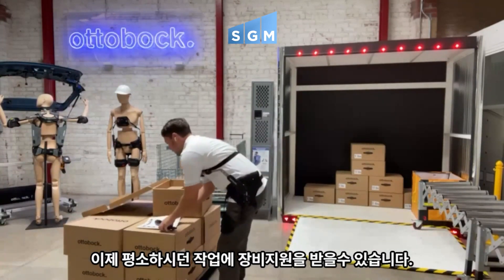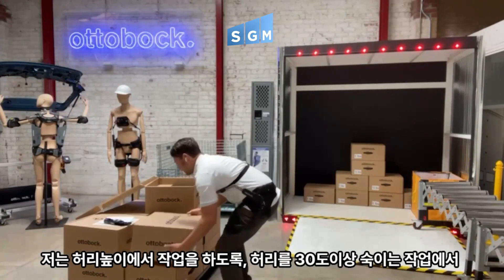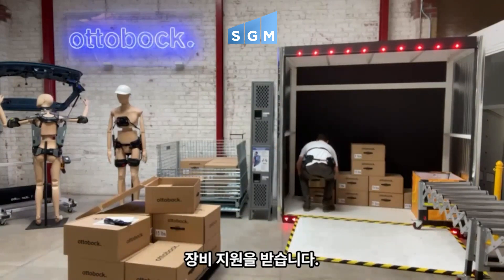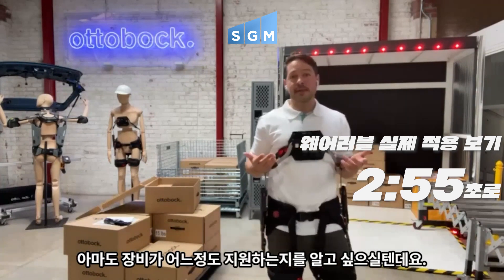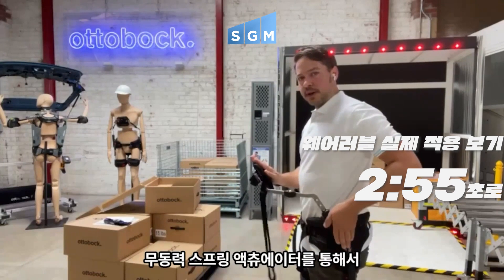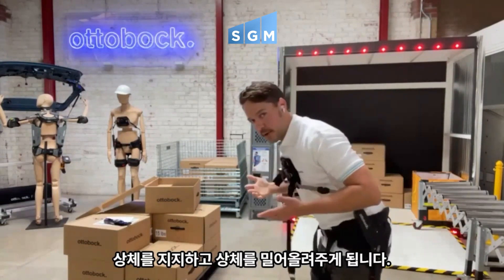The BackX is going to engage at about 30 degrees of torso flexion. So whether I'm lifting from a waist height level or going all the way down to the ground, I'm going to get that support to my lower back — it's something you definitely have to feel to really understand. You can see this spring, gas spring mechanism here, essentially wanting to move the torso up as I bend forward.